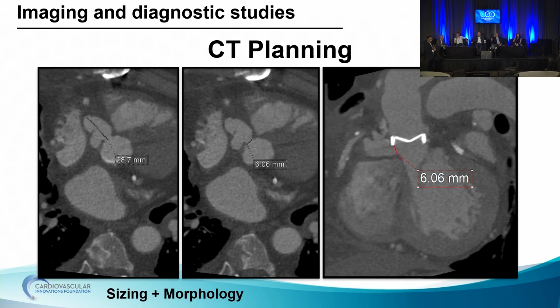So it is the LVOT. It's right below the valve. And notably, there is no involvement from a valve perspective, no perivalvular regurgitation. It's right below the valve. It's adjacent to that right coronary artery, but it's not involving the right coronary artery. Do you still, during the procedure, have to wire it just to protect it? Yeah, so you're asking how we access it right now.